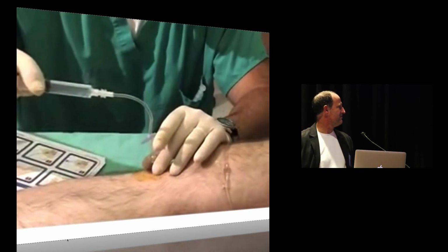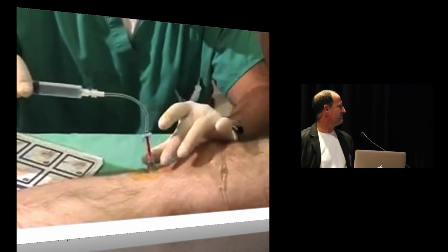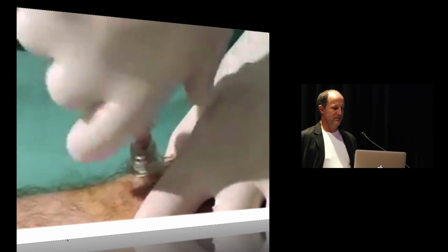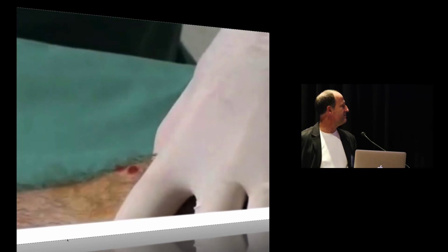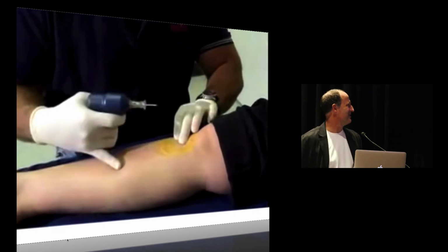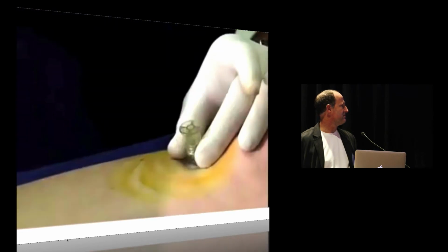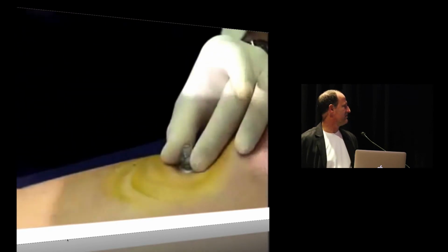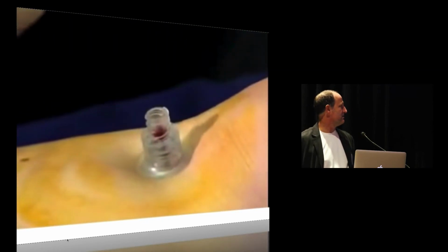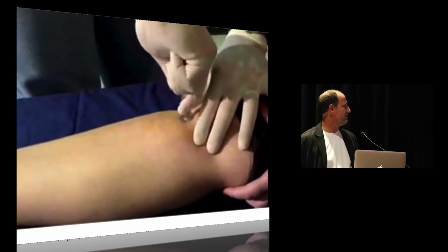Let's see if we get any bone. I'm aspirating that blood straight up the tubing. Can you see that, Brenda? Terrific. That does not hurt. All right. 0, 0, I'm coming straight up. 0. Now they're claiming it doesn't hurt. 0. 0. One more, that's all. Ready? Yep. We're in. Not bad, a lot of pressure. I'm removing. I can see blood now filling up the catheter there. Okay, I'm going to stabilize her leg. I'm going to turn and lift. And here it comes. It's coming.